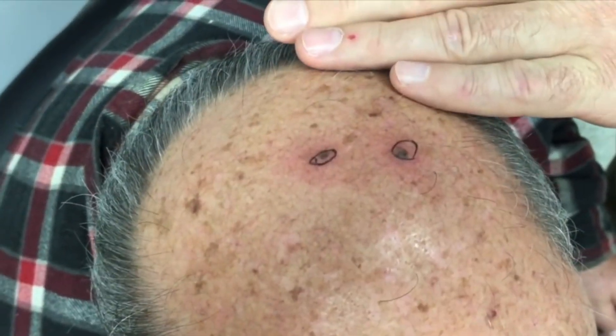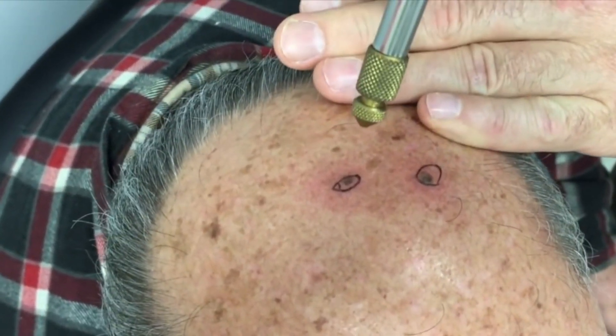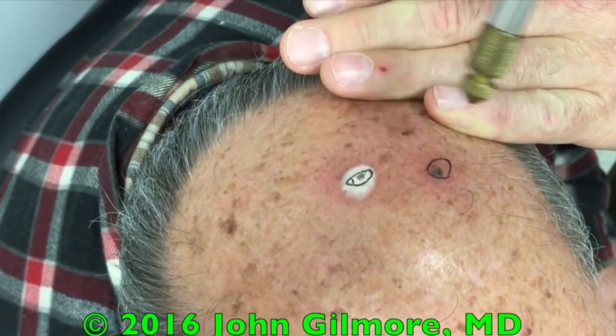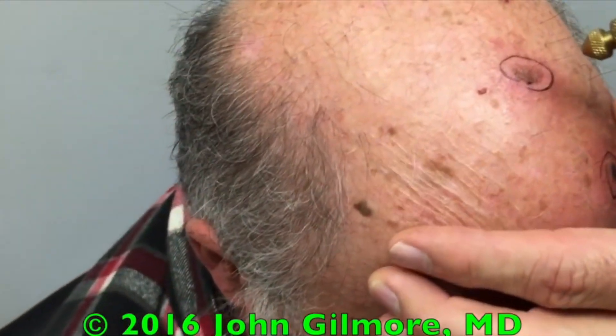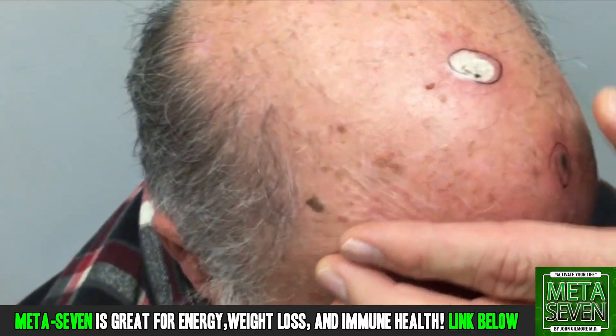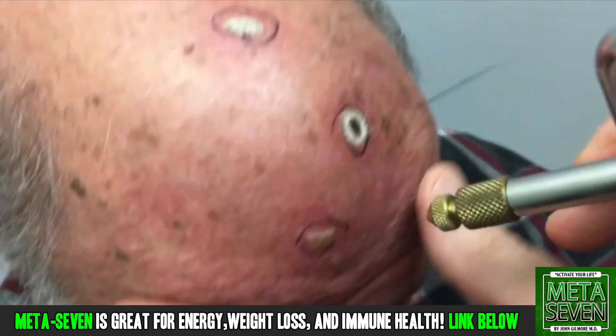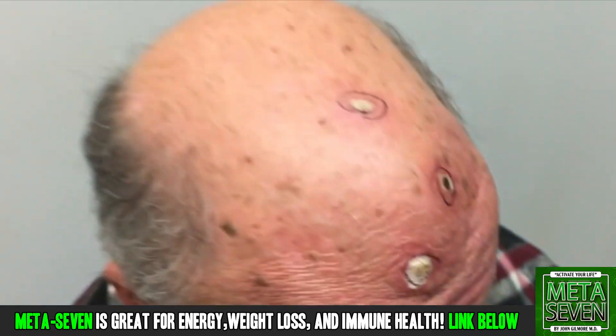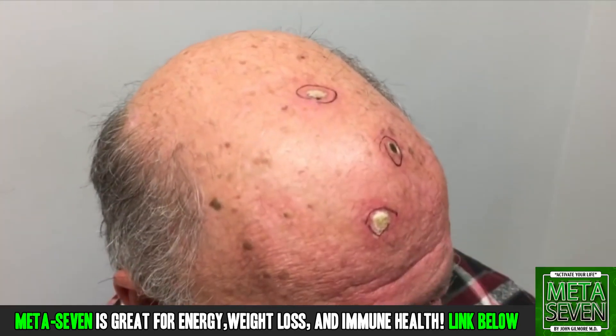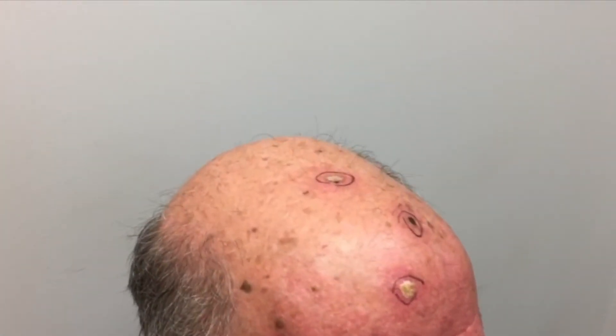All right, here we go — number two. Mr. Cruz, one, two. Now we're gonna get the big one — you ready? Three, four — that one really bothers me. Close tightly. Five. Hey, you did great! How was it? Painful? Oh, it's all right. You don't have to do anything special with these, but you might want to wear a hat for a few days because they're gonna get kind of irritated and red, and then they should dry up and just peel off or fall off.